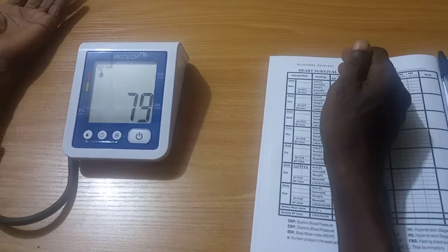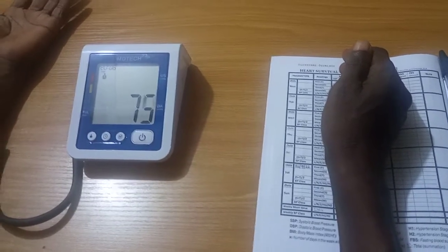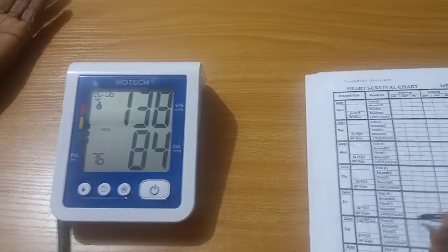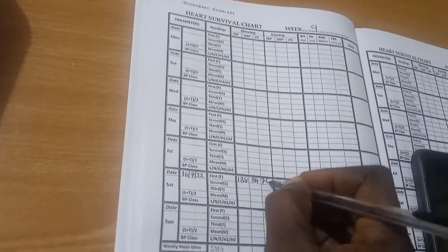Record the blood pressure three times, one to two minutes apart. First reading — Systolic: 138 mmHg. Diastolic: 84 mmHg. Heart rate: 76 beats per minute.